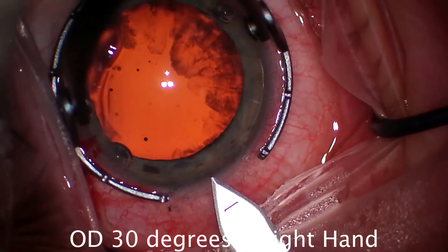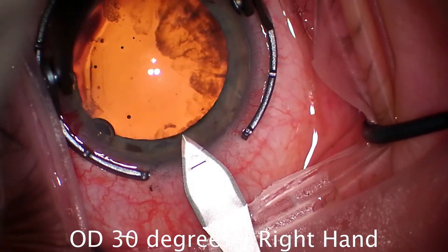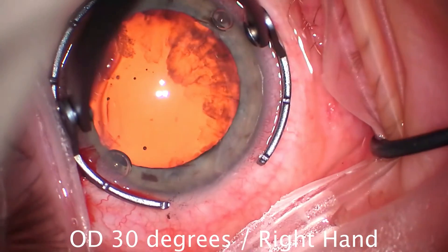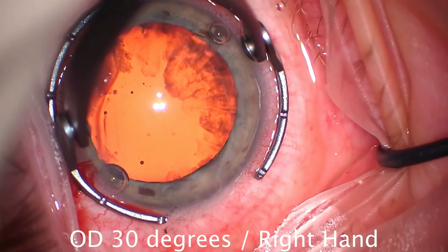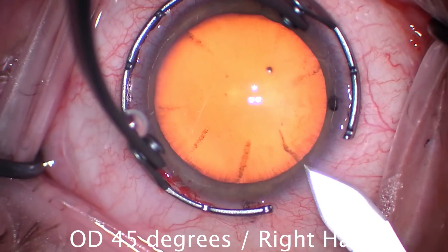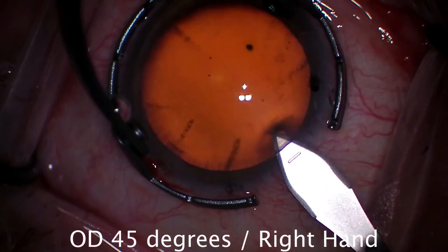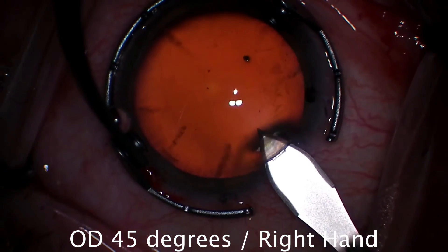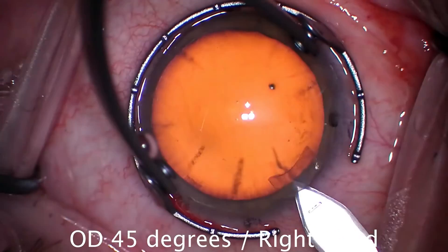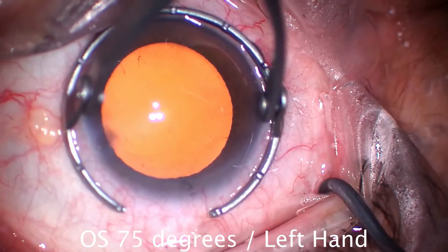Here's an example of 30 degrees steep axis on a right eye — we make the incision just like that, and it goes great. Now here's a different scenario on the same right eye but at 45 degrees. Notice how I shifted my position and shifted the speculum, and now we can make the phaco incision for the right eye at 45 degrees very easily.